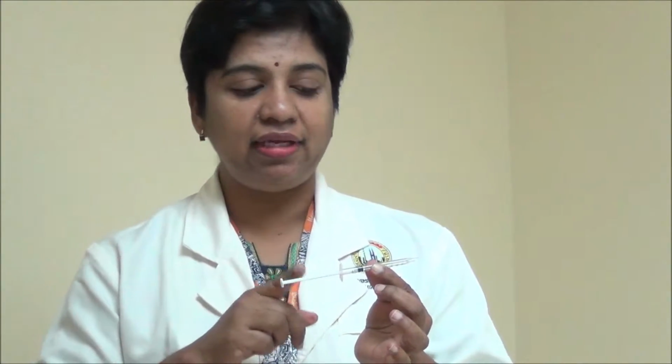In a syringe like this, the tip of the syringe and the inner part of the barrel is considered sterile. So please do not contaminate these two parts by touching. When you are handling and preparing, do not touch these two parts.